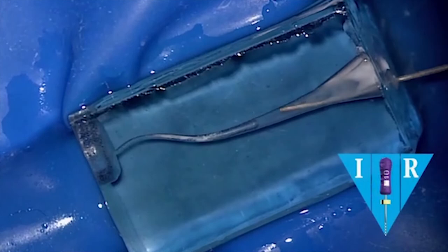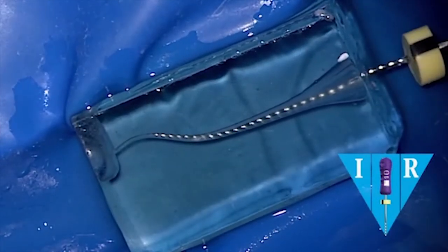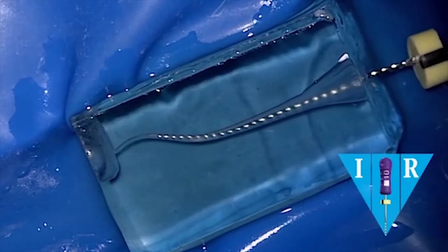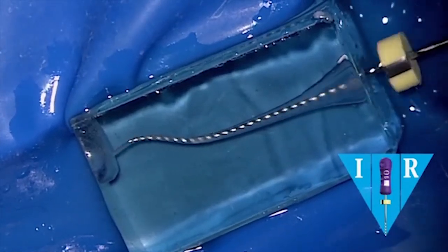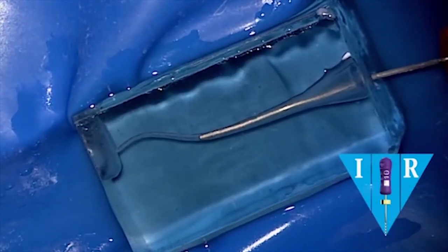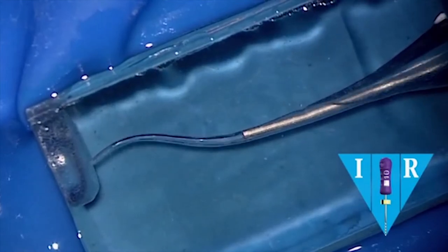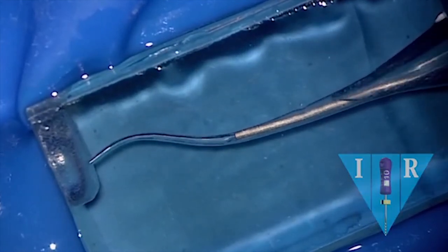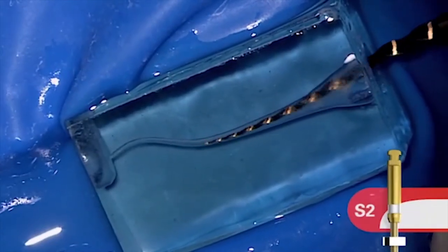A lot of colleagues skip these little steps, and that's how we get into trouble. We can recapitulate with either the 10 file or even use the much more flexible ProGlider to clear the canal, break up debris, and move it into solution so that we can re-irrigate. Notice we're moving solutions much deeper than the placement of the cannula.